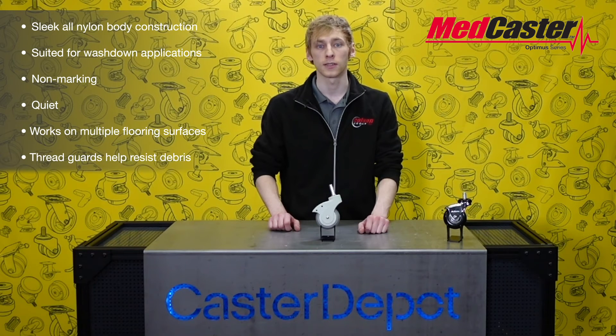Colson Group offers some of the highest quality casters in the world. Let's take a closer look at a couple of their premium IV cart casters. This is an Optimus Caster by MedCaster. As you can see, it has a sleek all-nylon body construction that is ideal for washdown applications. The resilient tread Performa rubber wheel is non-marking, quiet, and rolls easily across different floor conditions. There are integrated thread guards designed into the caster body and additional wheel thread guards, and each caster can support up to 140 pounds per caster.